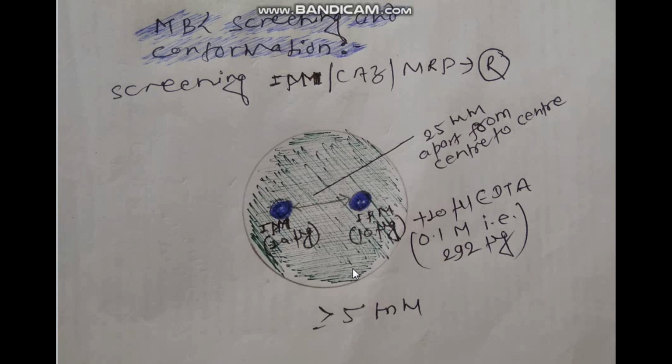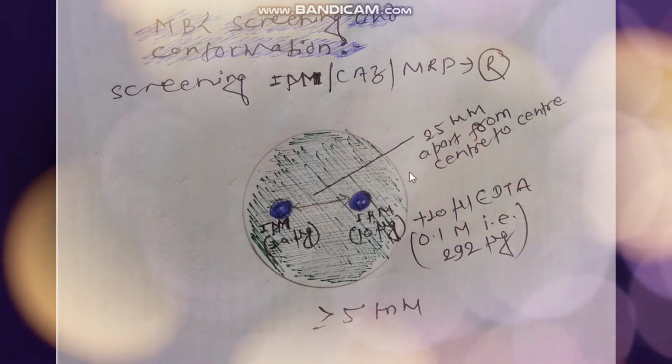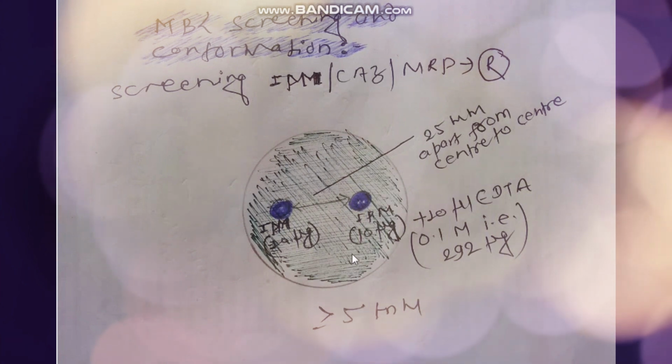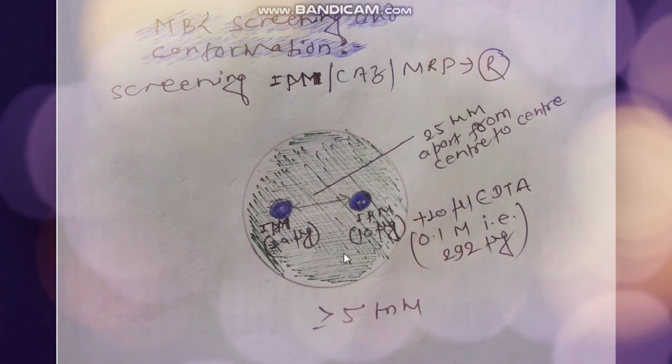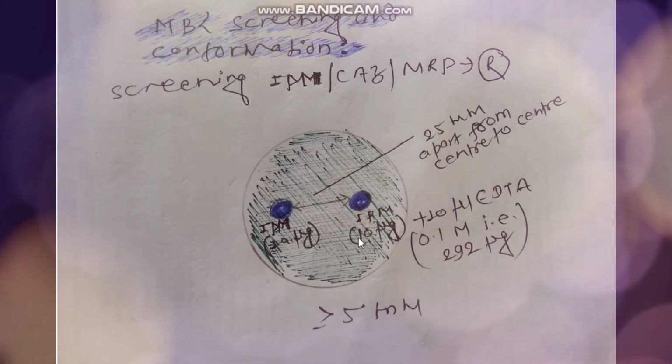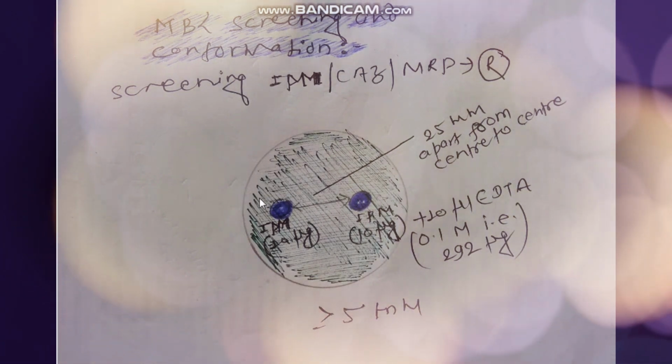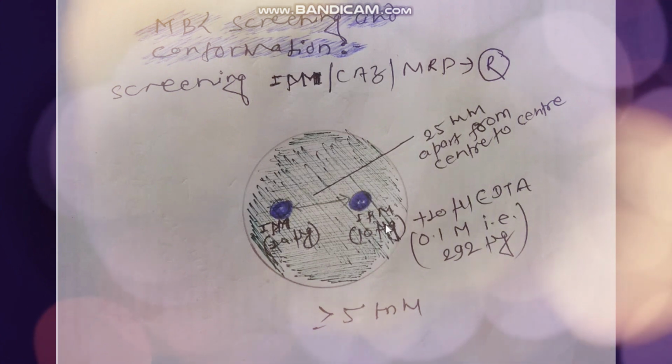The organism, 0.5 McFarland standard, inoculated in Mueller-Hinton agar with the drugs 10 microgram imipenem plus EDTA. Incubated overnight.